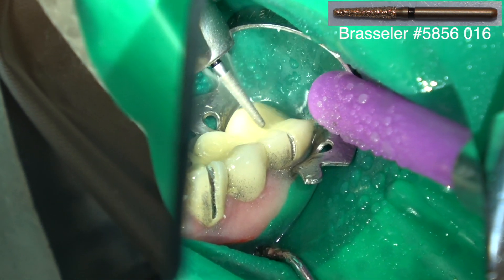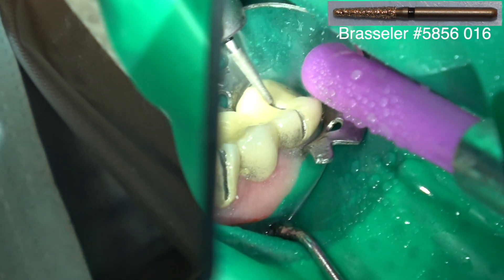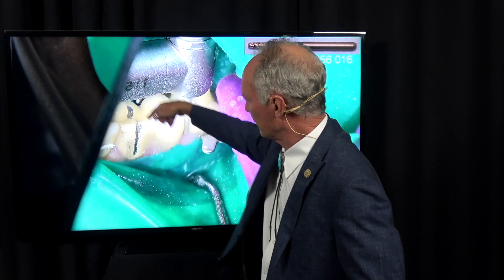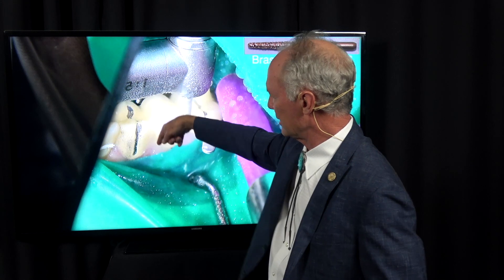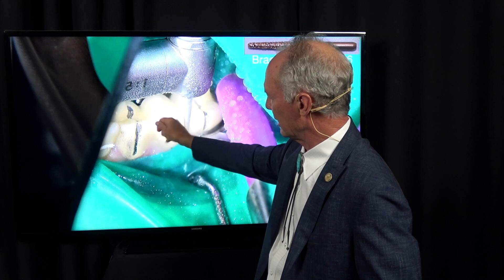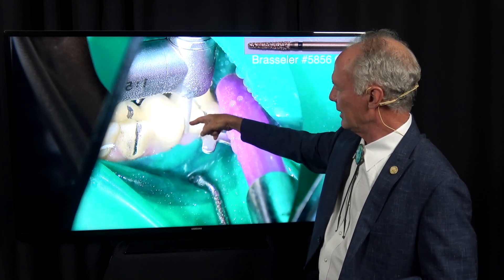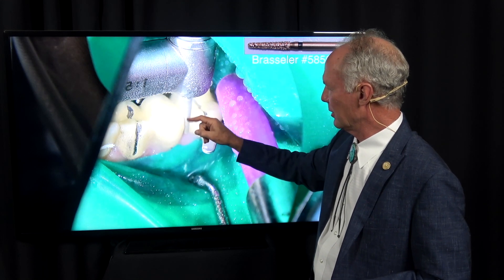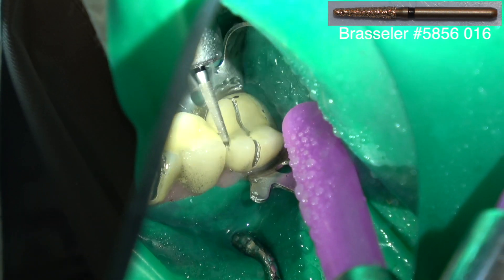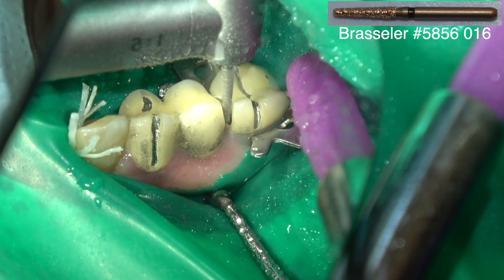The key when cutting a crown or a bridge off is that you've got to have space to move it into. If you're cutting off a crown, cut between the crown and the adjacent tooth with a thin coarse barrel diamond so you can torque that area into the space. If you're cutting off this bridge, you need to cut between the pontic and one of the retainers so you can move the pieces into that space. If you don't have a space to move them into, it's going to be very difficult to torque those pieces.